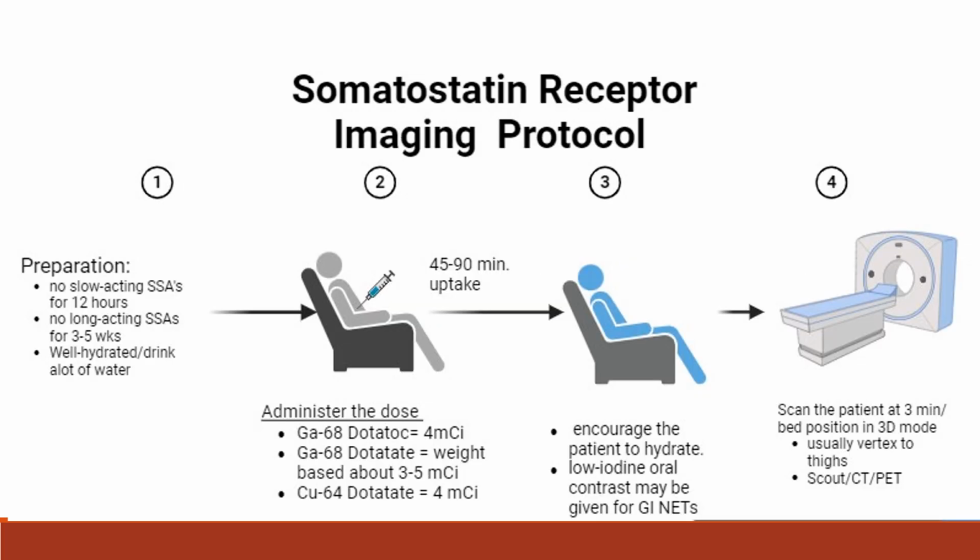All right, so somatostatin imaging protocol. Preparation is all of that stuff you see there. No somatostatin receptor analog drugs. Those are done to control their symptoms, and it's very difficult for the patients.